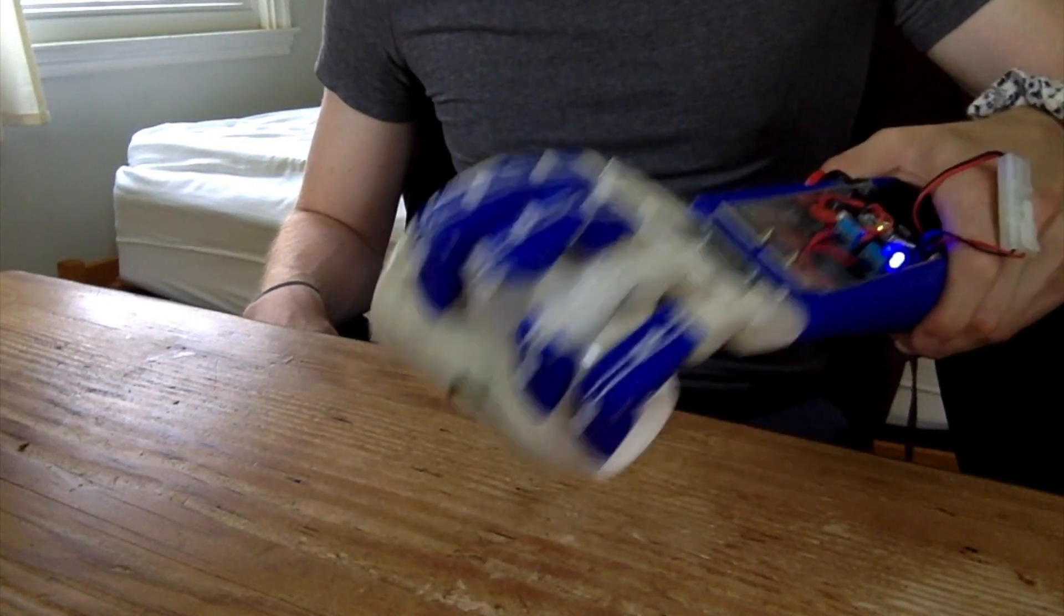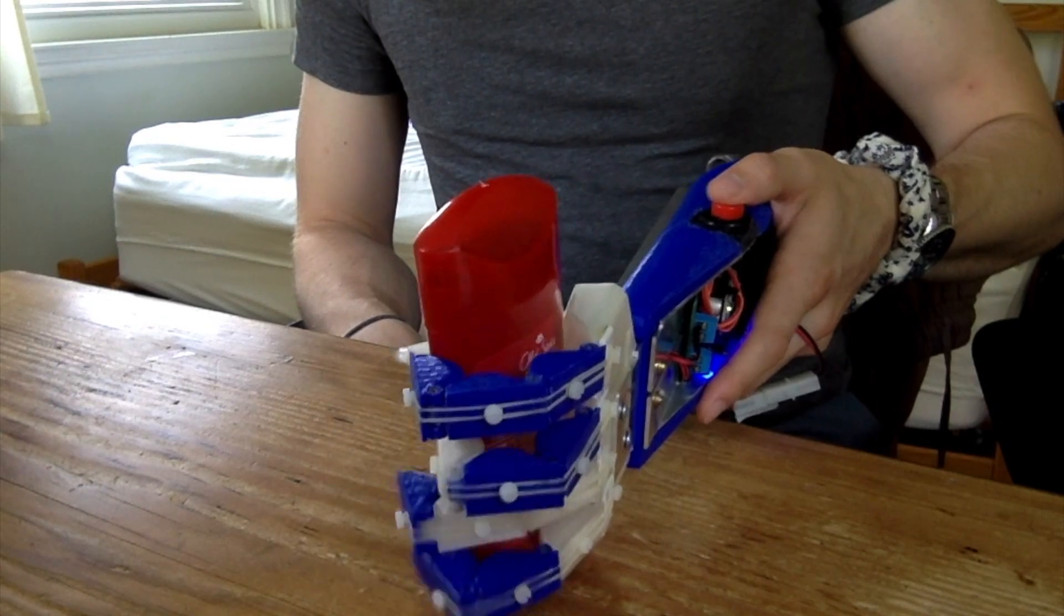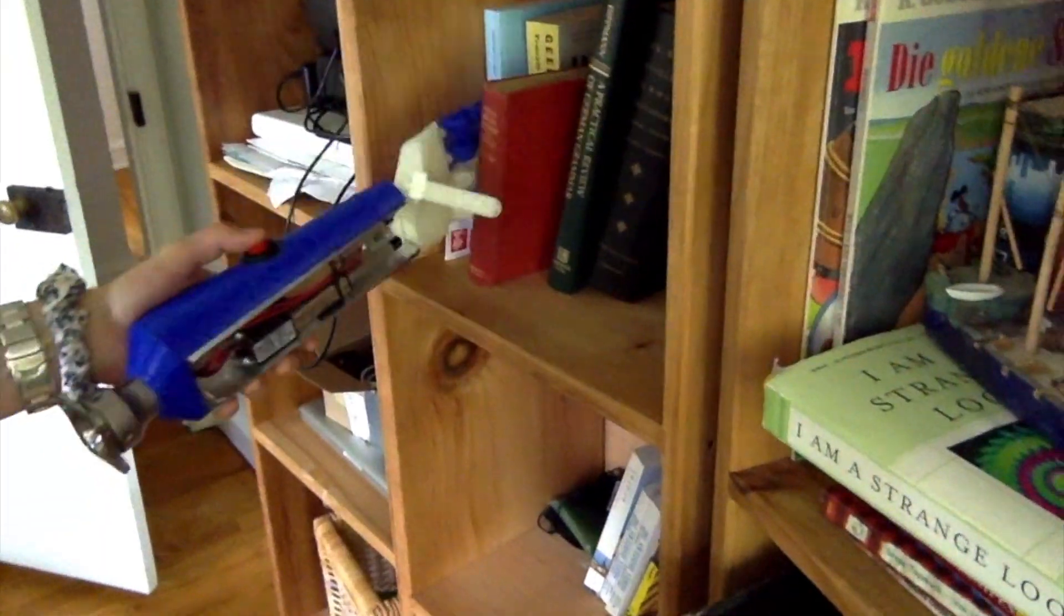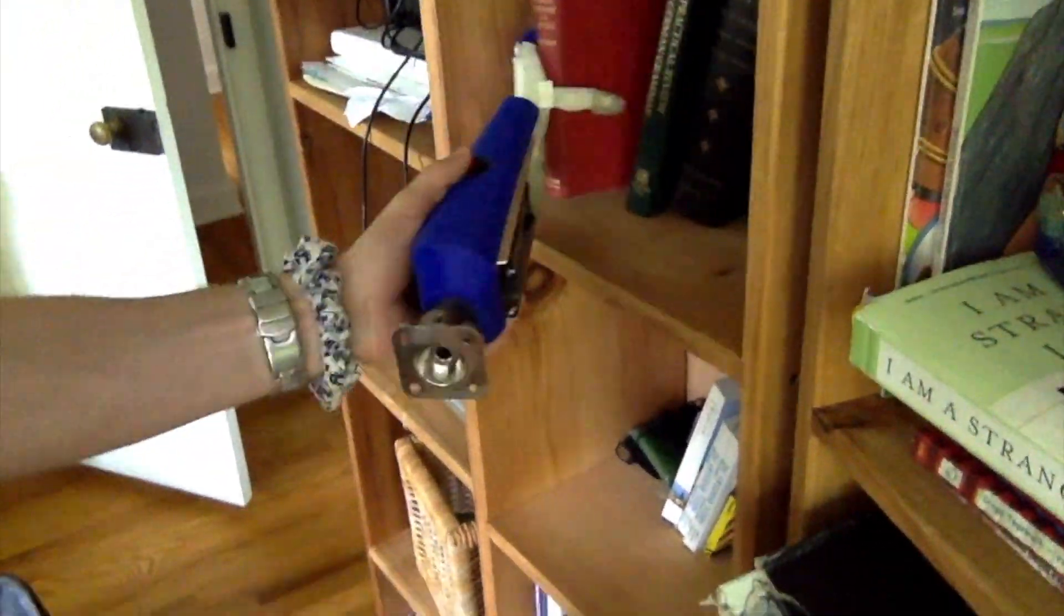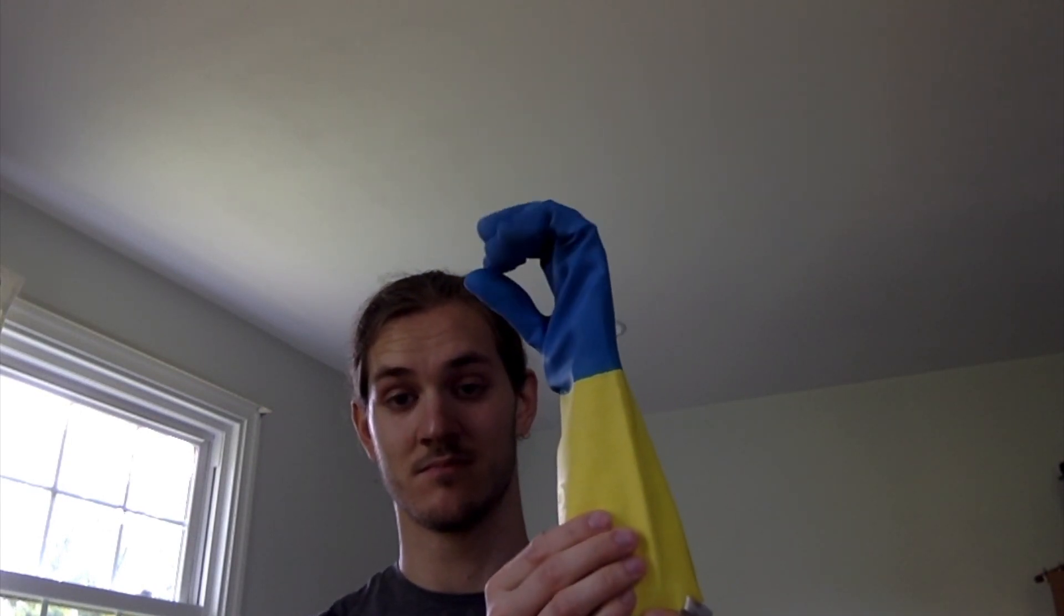As is, the hand can pick up and interact with a slew of household objects. However, the hand has a fairly low coefficient of friction, so heavy objects slip. Just like in the previous video, I'll use a rubber glove to increase the friction substantially.